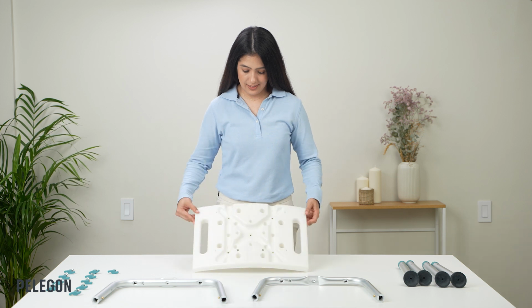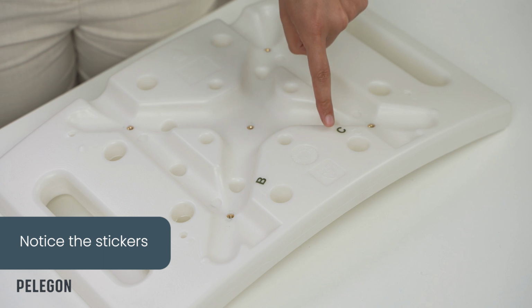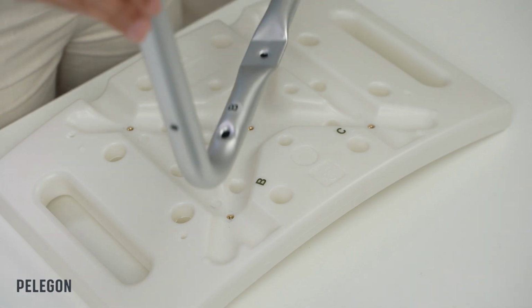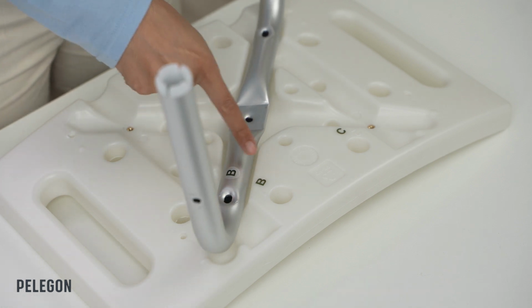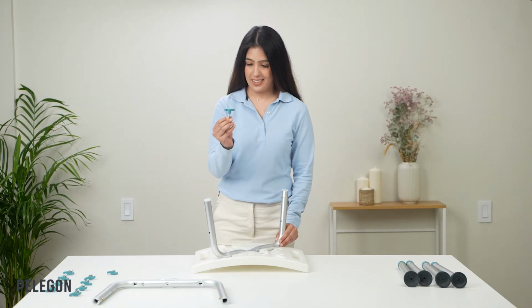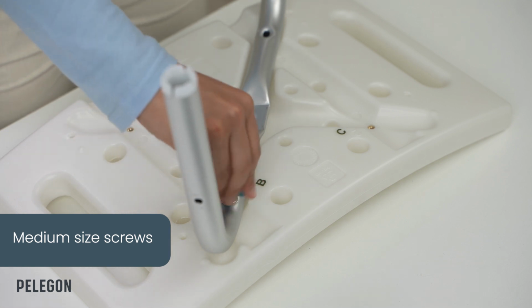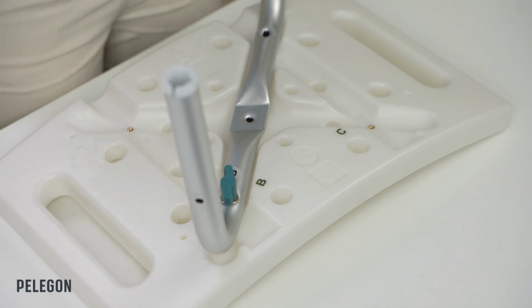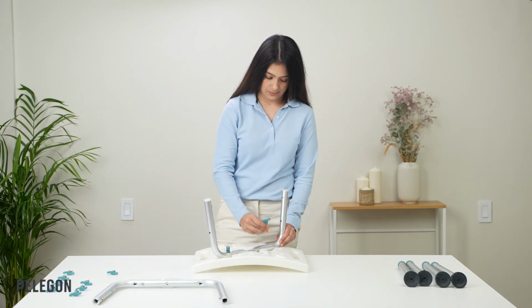First, make sure the seat is upside down so the stickers are visible. Then, place the U-shaped bar with the B sticker in place. Notice that the 2 B stickers should be aligned. Once in place, attach 2 medium-sized screws to the seat as so. You may need to apply some pressure while attaching the screws. It's always best not to fully tighten the screw until all of them are attached to the seat.